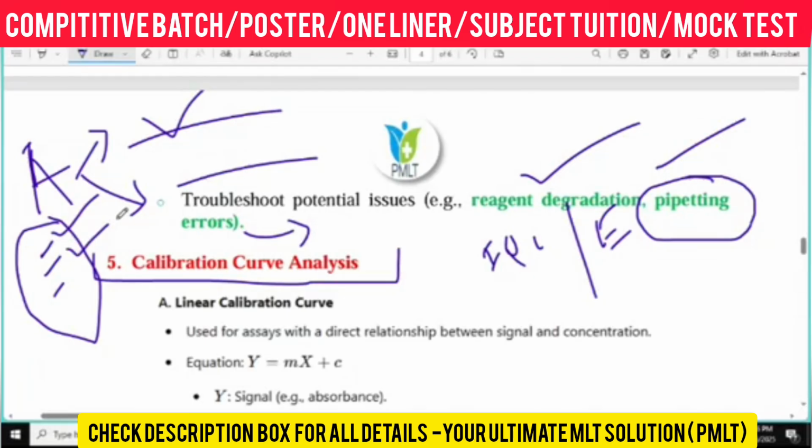And can anyone say what the post-analytical errors are? Like documentation, right? And report generating, yes or no? Understood. These kinds of error we have already understood.